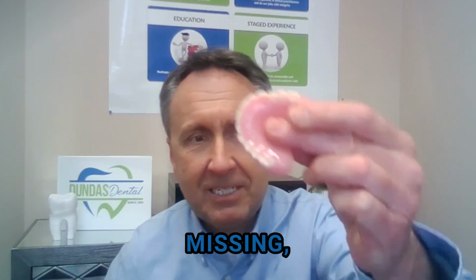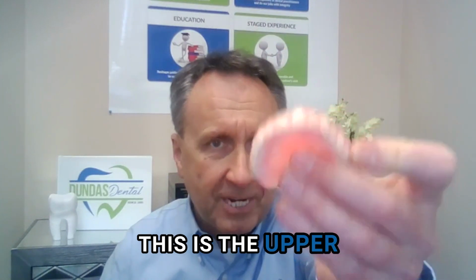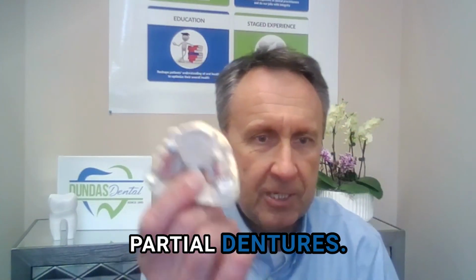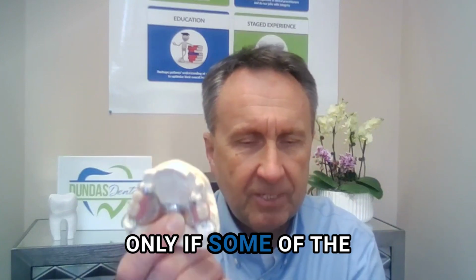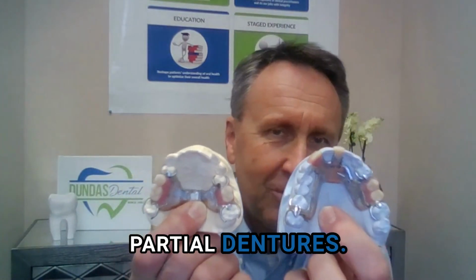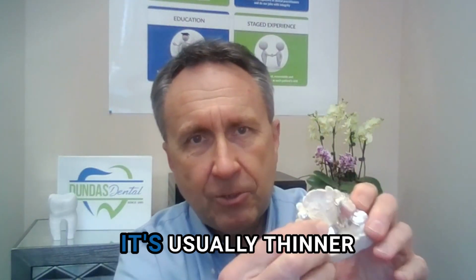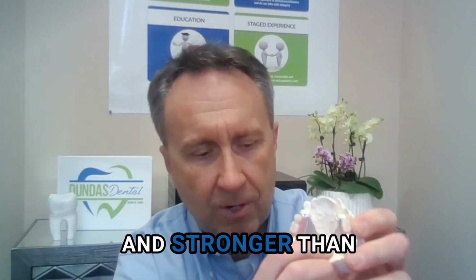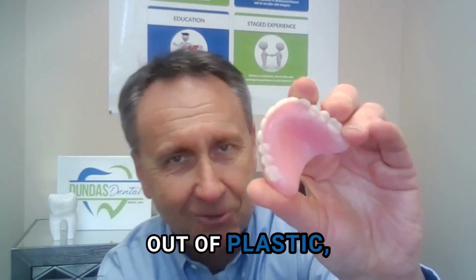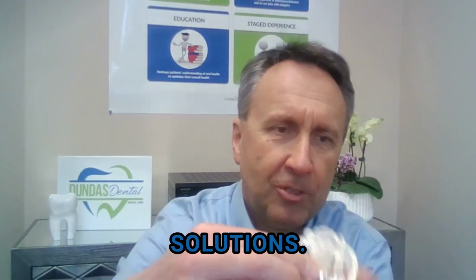If all the teeth are missing, people can have a full denture. This is the upper denture. There are also partial dentures, so only if some of the teeth are missing. I'm showing here cast partial dentures. We call them cast because there is a piece of metal right here. It's usually thinner and stronger than something like this, which is made just out of plastic, acrylic as we call it. So this is the partial denture solutions.